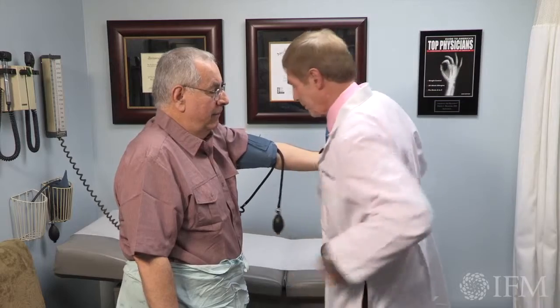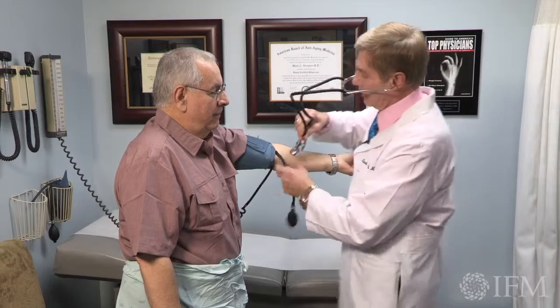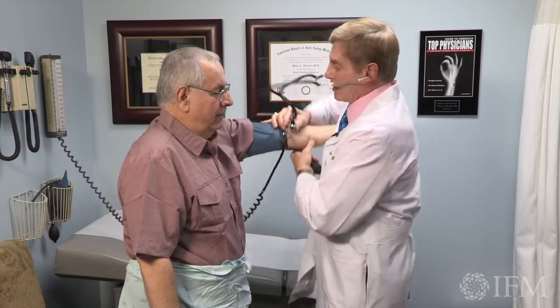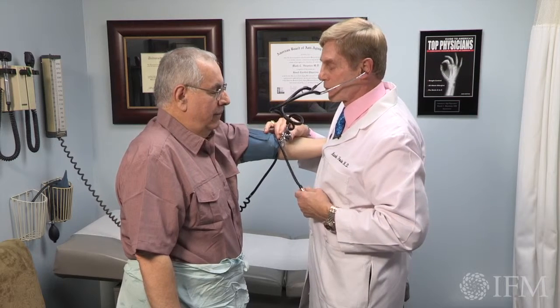Same thing — we're going to use the bell. I've got him locked in, completely relaxed. Close your eyes. Rhythmic breathe.